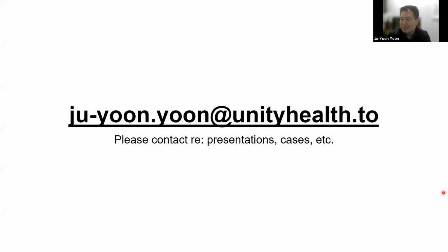Thanks very much for your presentation. Really interesting. I think to Phil's point as well, we're always very interested to have a look at these technologies, and we have looked at that Avenio. When we had it in the lab for a trial, the truth of the matter was that the throughput just doesn't work with the large volume of testing that we're doing. So I agree, I think it would be wonderful, and trying to automate is an excellent idea. The problem is that the reality of it isn't quite there yet for a big, busy clinical lab in most cases.